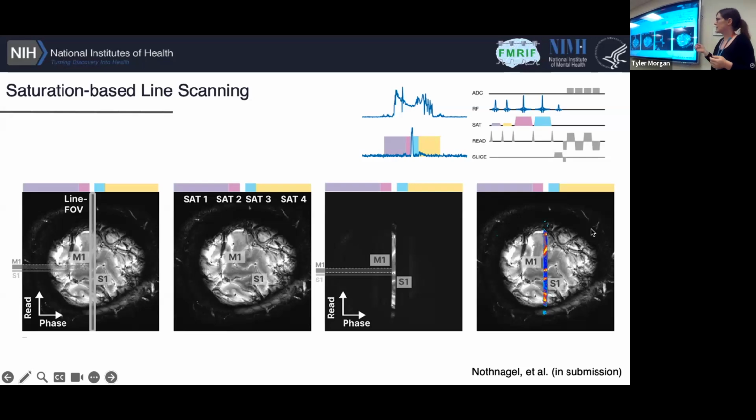But at the same time, if you can then image this quickly and at high resolution, you do gain something only in this dimension. And that's the whole point of line scanning. That's our inserted electrode through the cortex that we didn't actually have to open the person's skull to. Here's just an overlay of what that looks like on top.